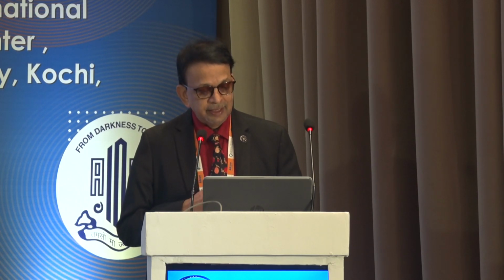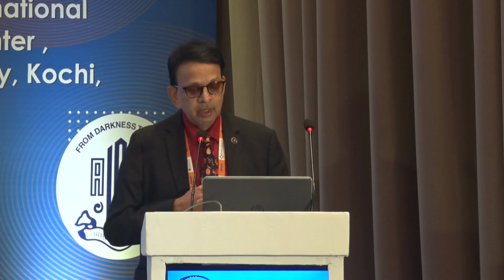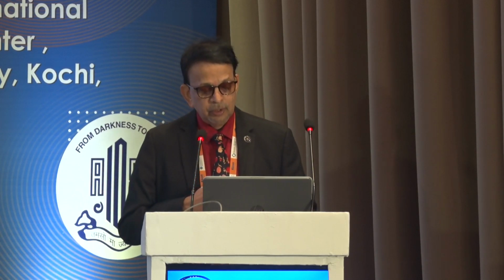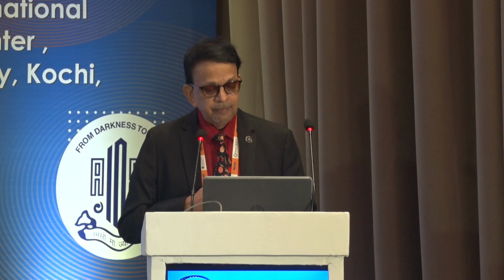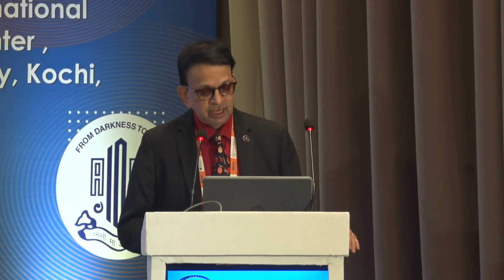You can see here how it is. It's almost like a black cataract. You can see here how the cataract nigra is there, and these are very huge, very thick cataracts, and the zonules are also a little weak. You need to be careful about lateral separation, bringing it up and making sure that you do not have much chatter or movement of the nucleus. So again, these are the parameters I use on a femto machine.